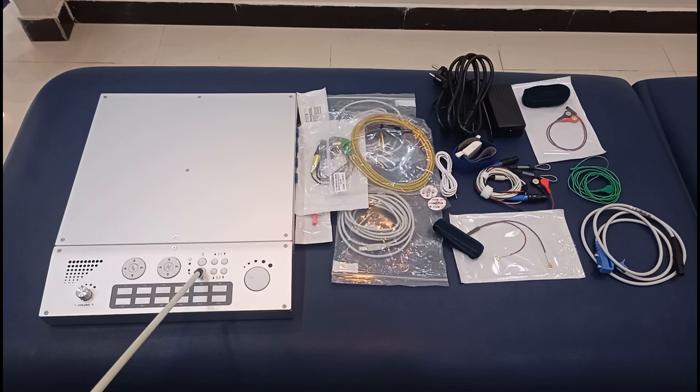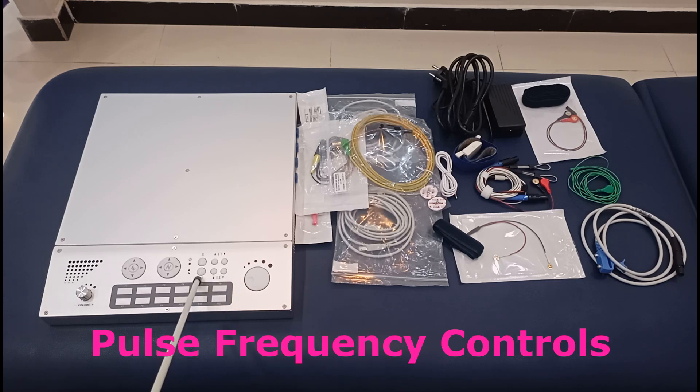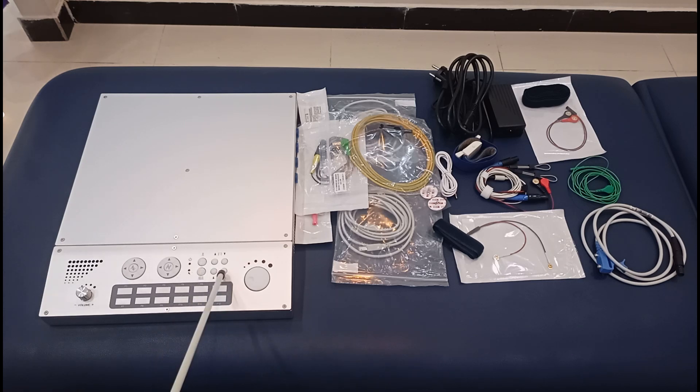This top button is for a single stimulation, and this is for repeated stimulation. If you want more pulses, you can fix the frequency and press this button and it will keep sending current again and again, so you don't need to press repeatedly — this is very useful. These two buttons increase and decrease the pulse width or pulse duration of the stimulating current. These can increase and decrease the number of pulses, like the frequency of the stimulating pulses.